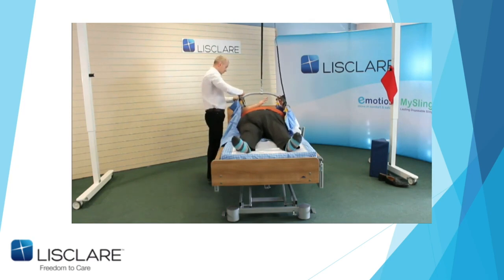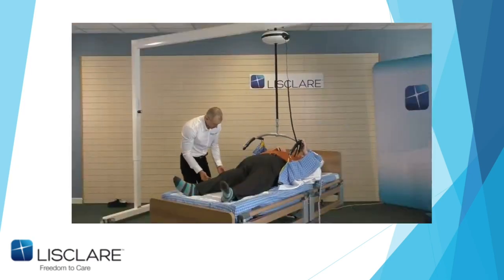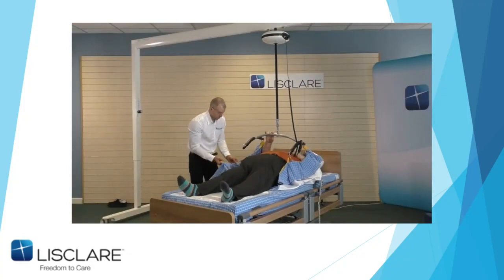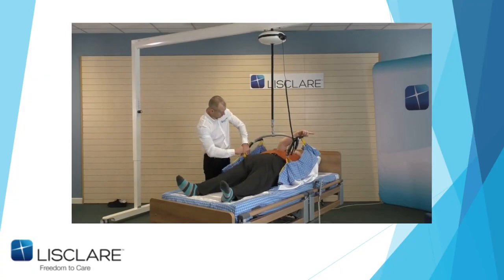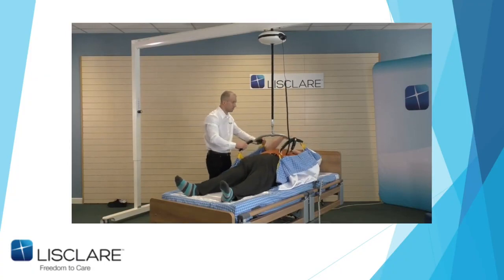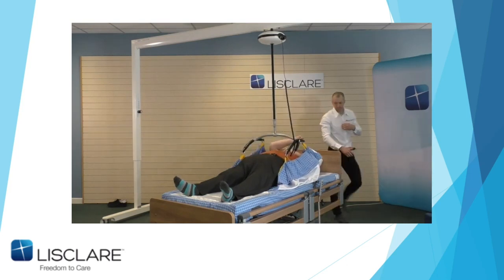Unfortunately, in this case, we have a gantry. And it's just a straight gantry. So I'm going to show you why I so like the casters on the gantry. One of the reasons, obviously, is if that's the exit point to the room, and you've done your lift, the gantry can be moved. So John's just going to move the gantry slightly up above me.